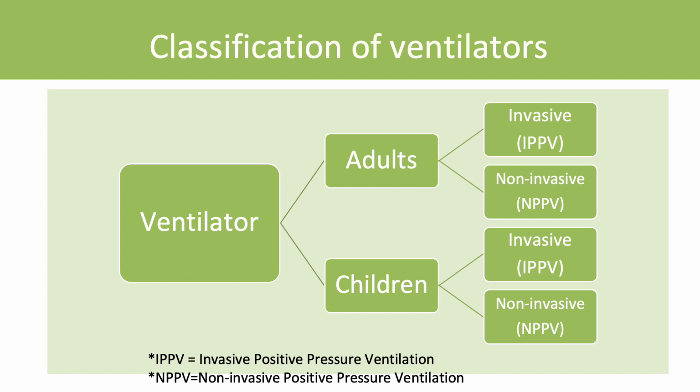It is important to note that nasal continuous positive airway pressure, CPAP, and high-flow therapy are not classified as artificial ventilation, but as oxygen therapy.